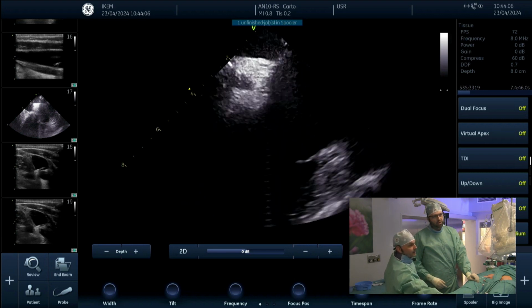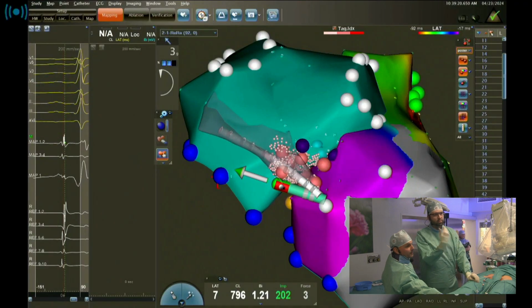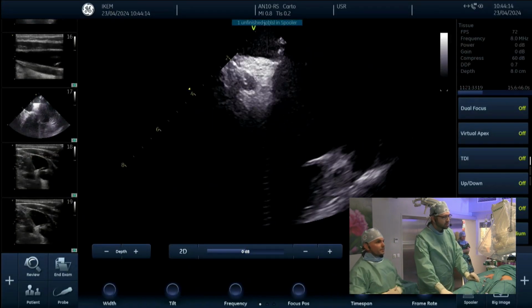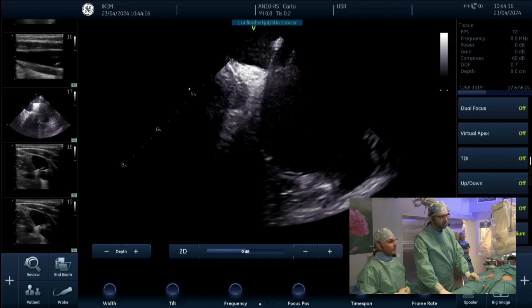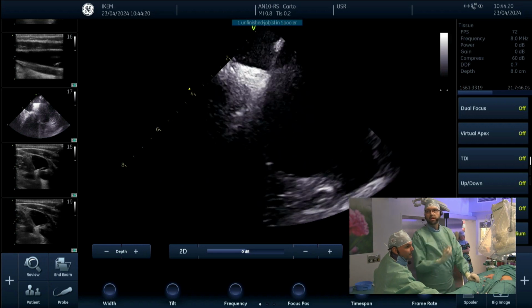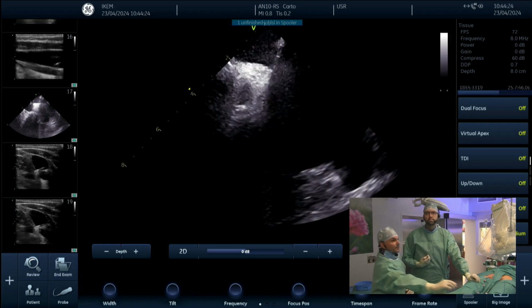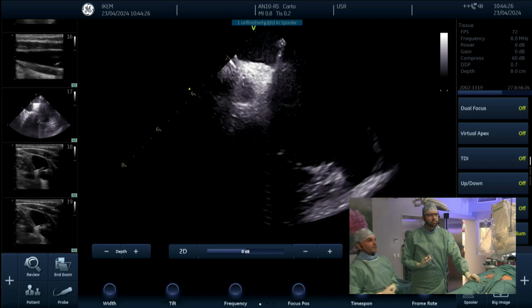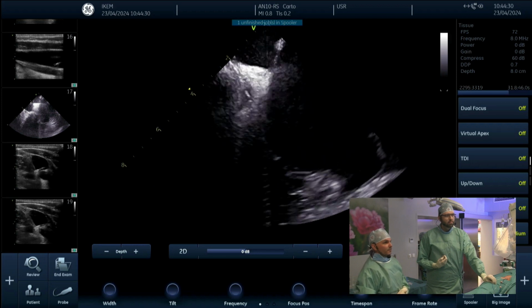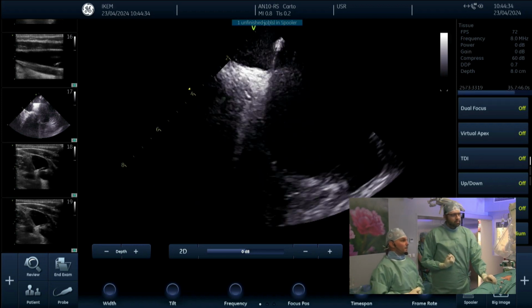But for those who are not familiar with eyes, here we are on the posterior part of the coronary sinus ostium, and here you can see that we are trying to have such a position like this, to have a vector pointing posteriorly. That's the pyramid space we were talking about. This is from left, this is from right, and this is from below in this posterior part of the coronary sinus ostium. Vessels are going down here.